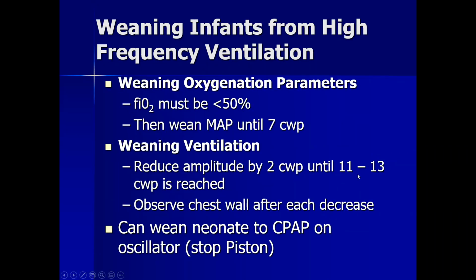FiO2 is the other one that controls oxygenation, right? You could do either one, but it would be better to do the MAP because it didn't show good lung distension on the x-ray.